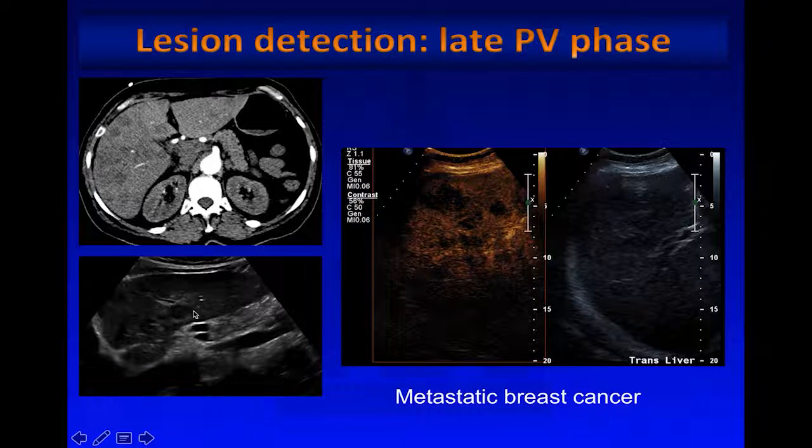She has some liver lesions you can see on the grayscale ultrasound, but she came for biopsy, and so we gave her contrast, and you can see with contrast that there are many more lesions. They're typically hypodense to the liver. And so you can find perhaps a more favorable target to do a biopsy in a more superficial location or perhaps a larger lesion. And this was a patient with metastatic breast cancer. So again, you can use the later phase after you've characterized the target lesion to look for additional lesions in the liver.